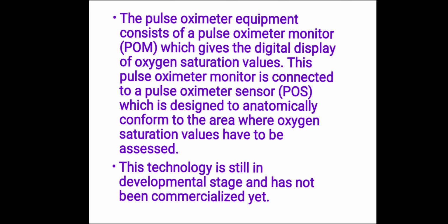This pulse oximeter monitor is connected to a pulse oximeter sensor assembly, which is designed to anatomically conform to the areas where oxygen saturation levels have to be assessed. This technique is still in the developmental stage and has not yet been commercialized.